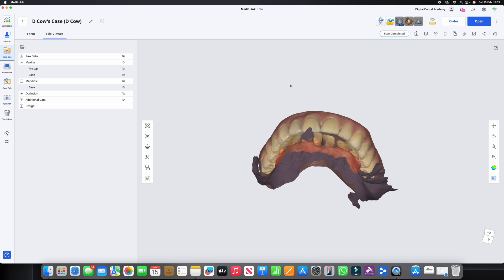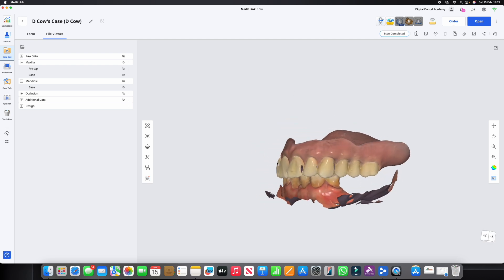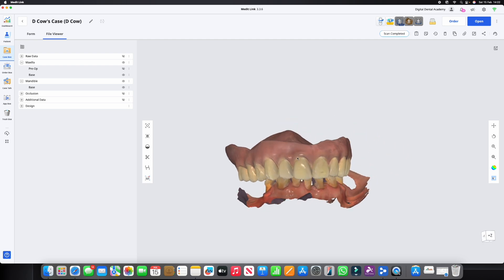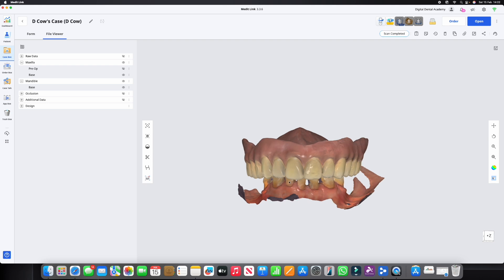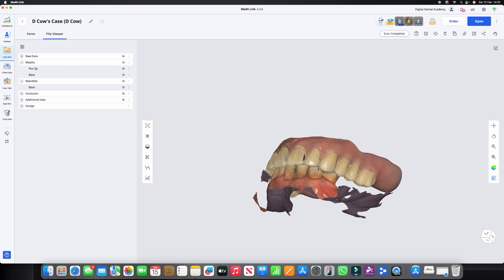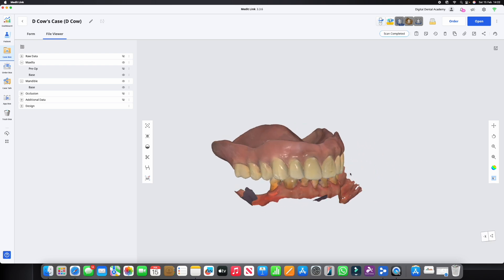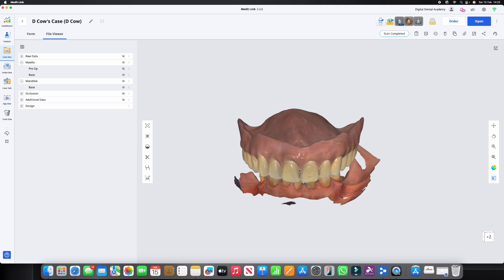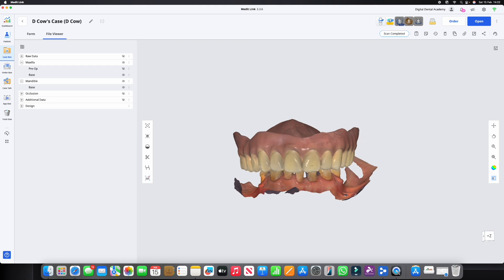This denture is scanned in its entirety so that we can then capture the opposing arch and then use the left and the right bites to capture the OVD. So we've got now the complete prosthetic envelope, we've got the occlusion with the OVD to the opposing arch with exactly where we want this fitting surface to be.